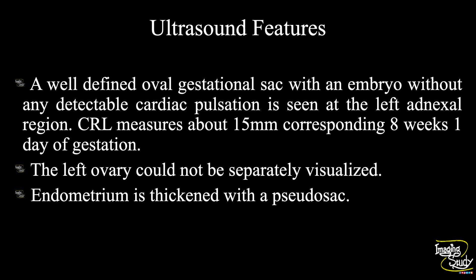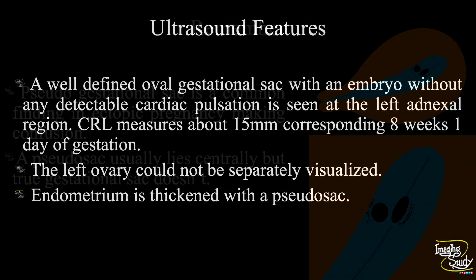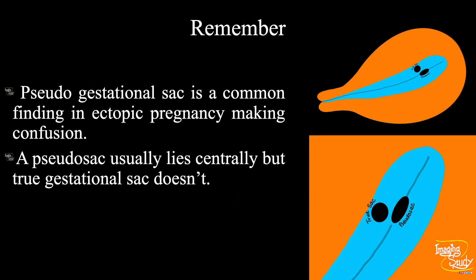So the diagnosis is left adnexal ectopic pregnancy. The take-home message: pseudo gestational sac is a very common finding in ectopic pregnancy, causing confusion. Remember that the pseudo sac usually lies centrally, but the true gestational sac lies on the lateral surface. We know that the blastocyst implants not at the center but at the endometrium, so it lies slightly laterally.